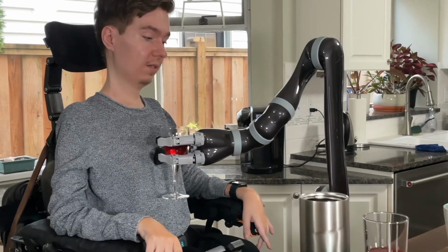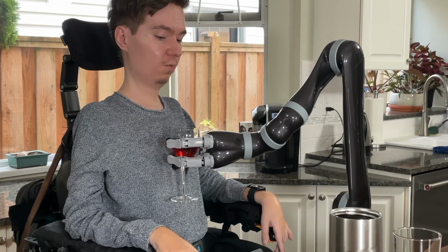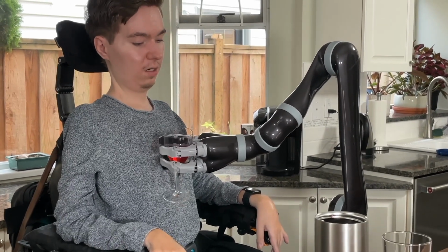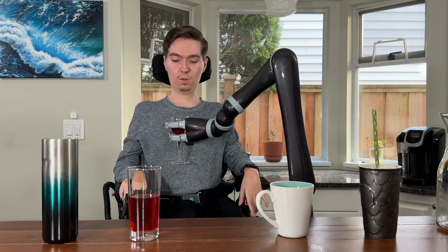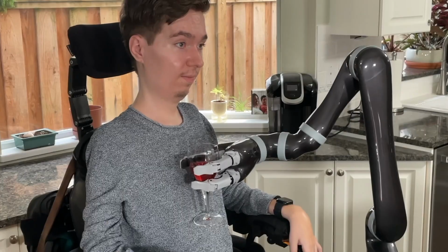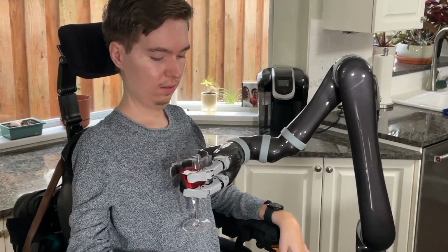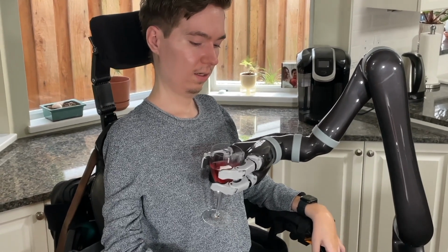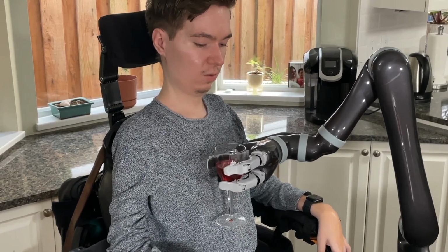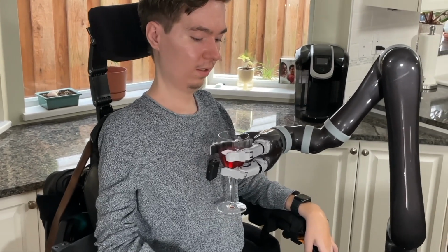And now I know that for the drinking motion, we're going to need to be using Jaco's wrist a lot. And if you look right here, this is not going to line up very well with our mouth. So I'm going to use B3 to just aim Jaco's fingers a little bit differently. Now we can see that this is going to tip the drink nicely into our mouth. So we're going to lift it a little bit higher.